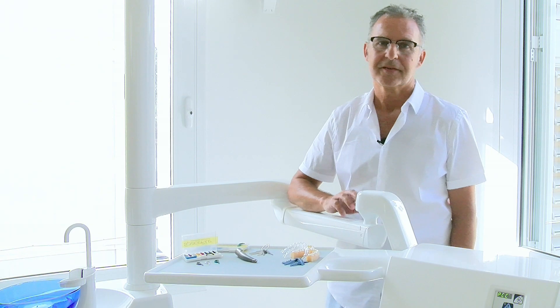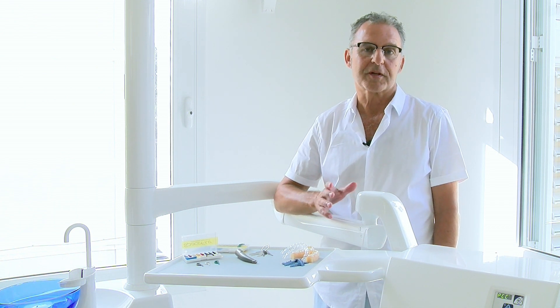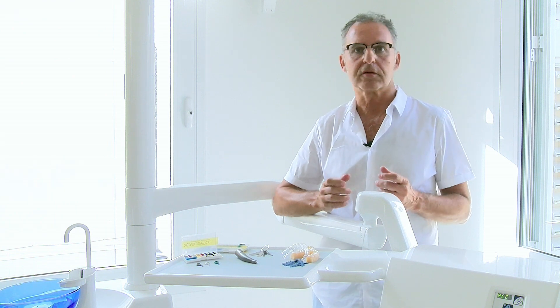Performing stripping with SpaceFile files. We can certainly perform stripping manually — it's the easiest way, but it's slow, a lot of time in the chair, and very annoying for the patient, moving this way and that, ending up half dizzy. And if we use a grinding disc, I'm the one who ends up half dizzy, because there's soft tissue risk and cuts, and my coronary suffers.